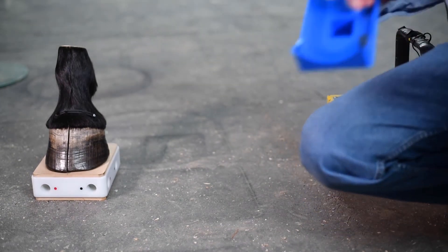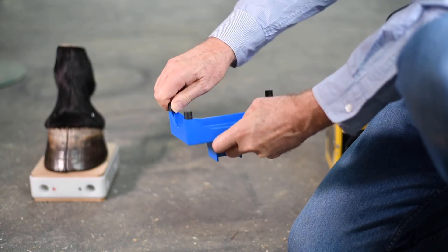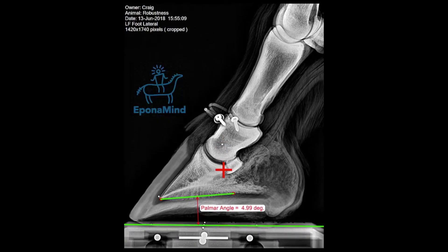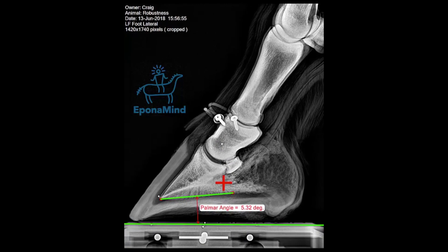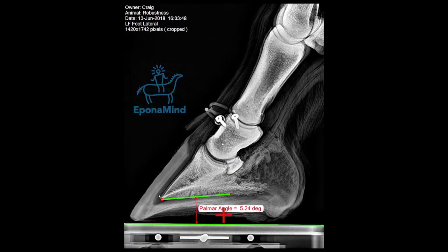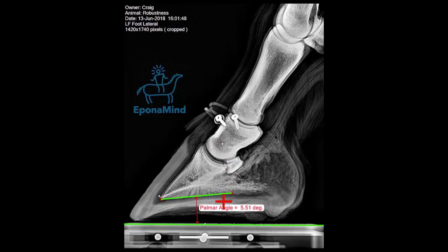When using the block riser kit, you can also get EponaCam extenders — you put them in and that will raise the height of the EponaCam by half an inch, so it'll again be at the right height for the new block. Regarding the height of the block relative to the generator, this demonstration shows the palmar angle measurement is pretty robust to differences in generator height and block height. So many people worry about this more than they should — things can be quite robust.